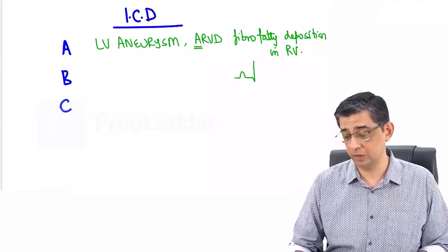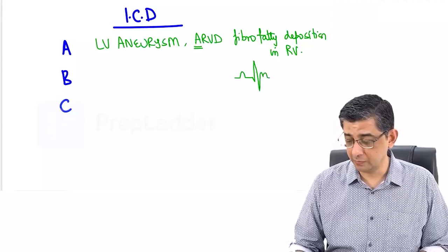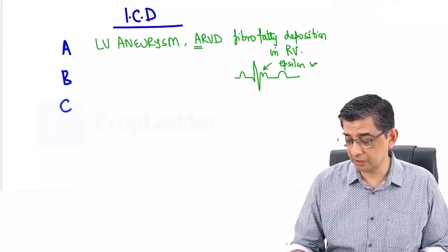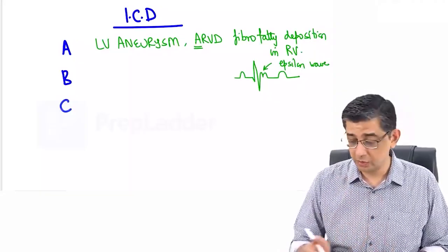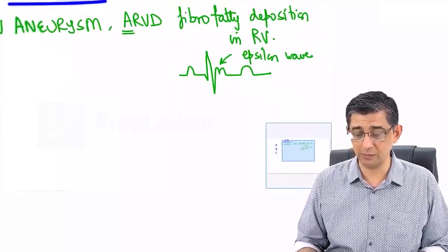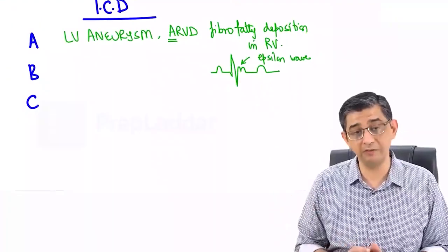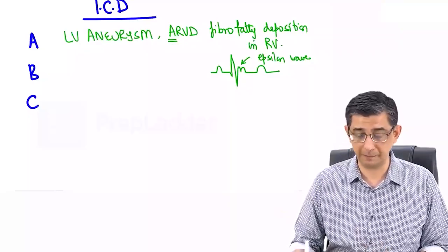In fact, if you do an ECG of a person with arrhythmogenic right ventricular dysplasia, you might be able to pick up an abnormality which is very characteristic and is called the epsilon wave. This finding will be present right where the J point should be present. Right in the starting I mentioned no isoelectric point. So at the exact area I've just shown, this peculiar wave is present, called the epsilon wave, and it helps you in identifying ARVD. This is obviously if the person comes in advance, when he was symptomatic, having syncopal episodes, and you did an ECG which showed this characteristic manifestation.